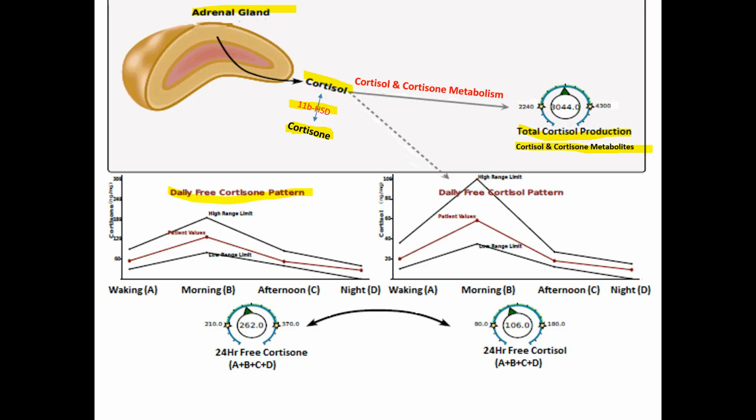Now in this case, that also is not low. It's either normal or elevated. So you have pretty good confirmation here that if the patient's taking a glucocorticoid, it's not suppressing, at least not entirely, the cortisol production, and that's a good thing to see. And then you can evaluate with a little bit more detail, what's the diurnal pattern looking like, and that sort of thing.